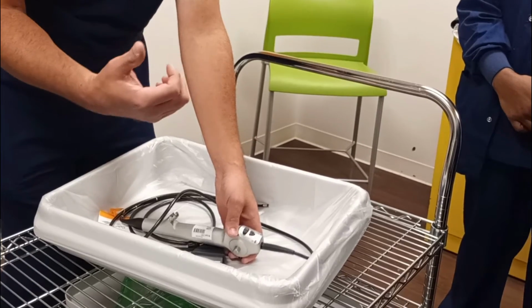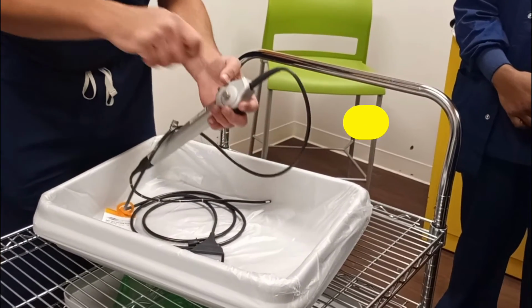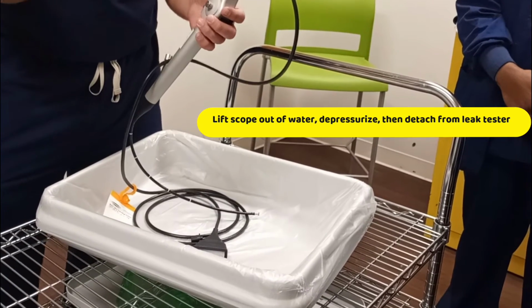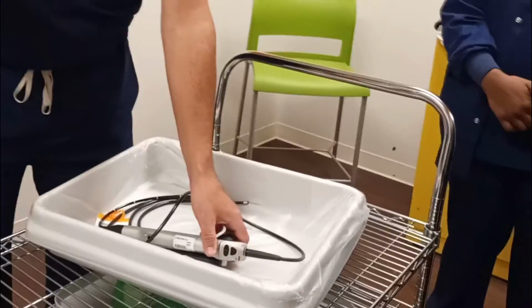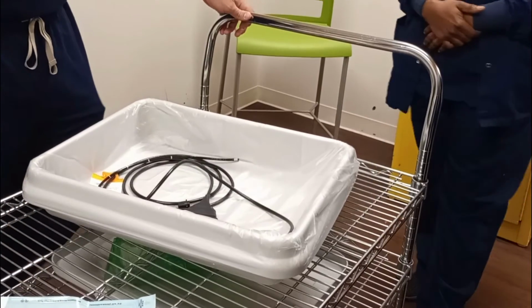Just when you detach it from the scope, lift the scope out of the water, depressurize it back down to 0, and then detach it from the scope before you drop it back into the water. Per our IFU, we recommend doing both a dry and a wet leak test.